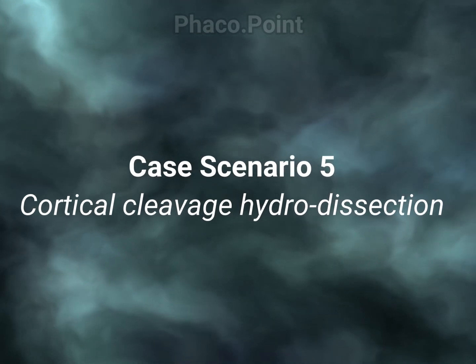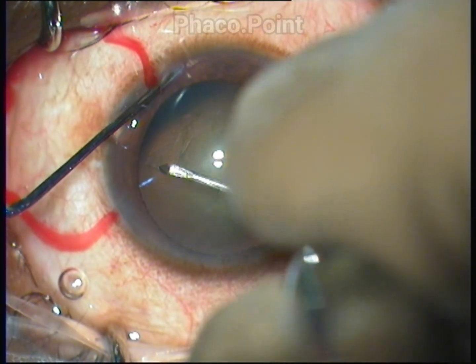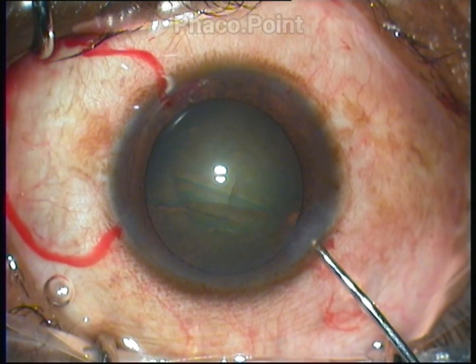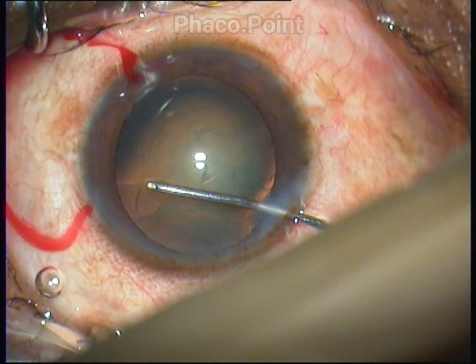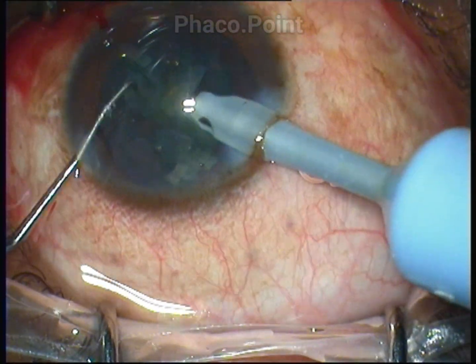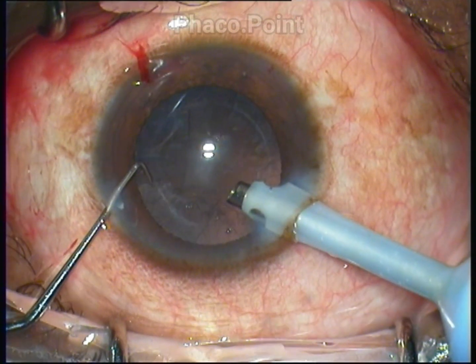Prevention is definitely better than cure, and the best way to prevent an epinucleus shell from happening is to do a proper cortical cleavage hydrodissection as described by Dr. Howard Fine. Using a 26-gauge bevel cannula carried underneath the edge of the rhexis, the anterior capsule is slightly tented up, the cannula is pushed towards the equator of the bag, and a small aliquot of fluid is injected with sufficient force to create the cortical cleavage hydrodissection. If you successfully manage the cortical cleavage hydrodissection, you will find that at the end of nucleus management, the capsular bag is pretty empty of epinuclear material and you just have some stray cortex to wash away.